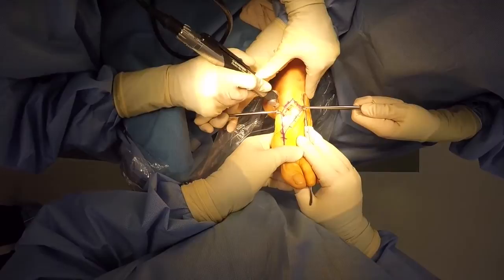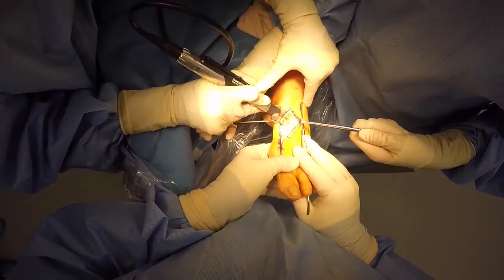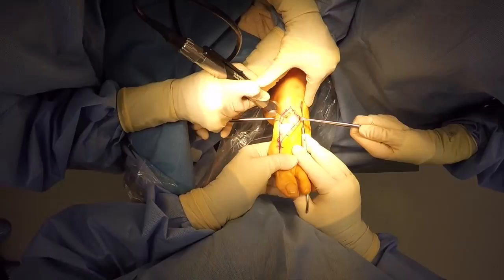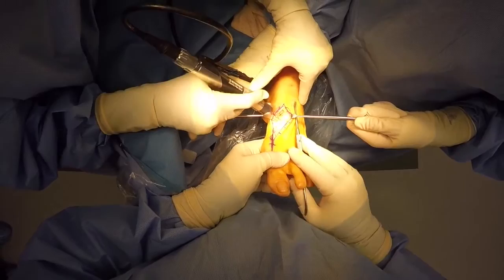Our first osteotomy cut is perpendicular to the long axis of the first metatarsal. This is a very thin slice of bone meant to remove the subchondral plate from the base of the first metatarsal. We make our second cut in the medial cuneiform, and we do this cut at an angle, therefore exacting our intermetatarsal correction once the cut surfaces of the bone are opposed.